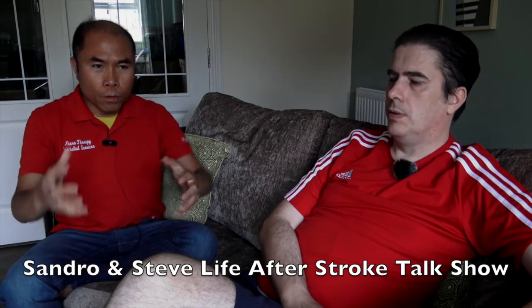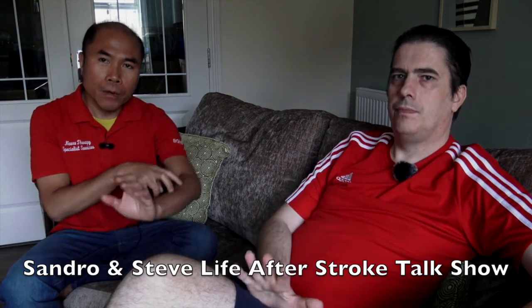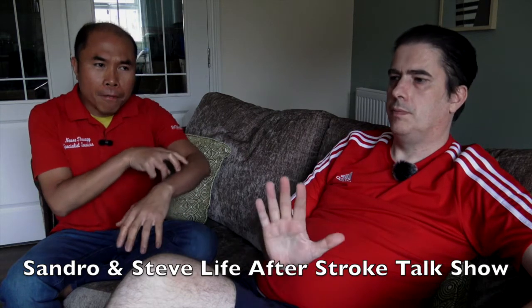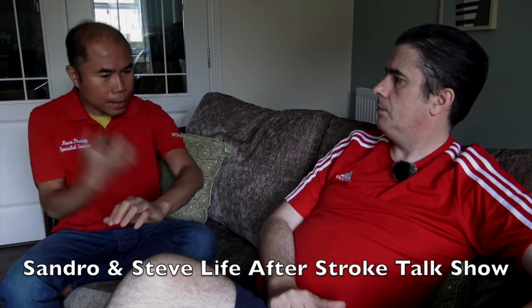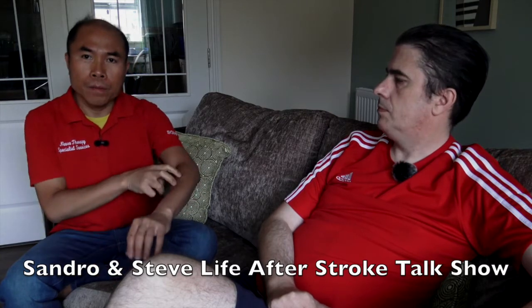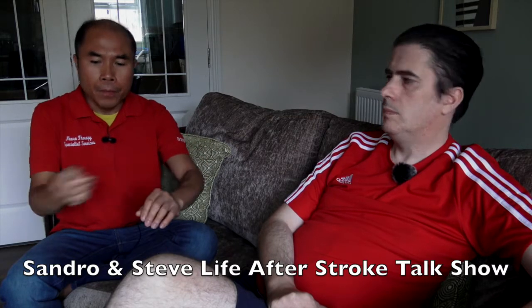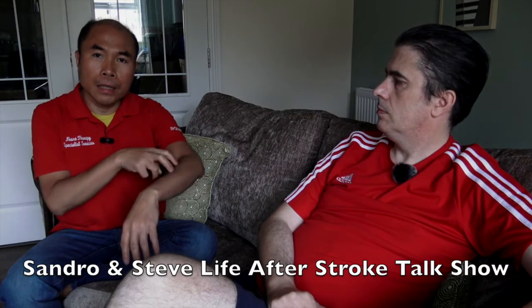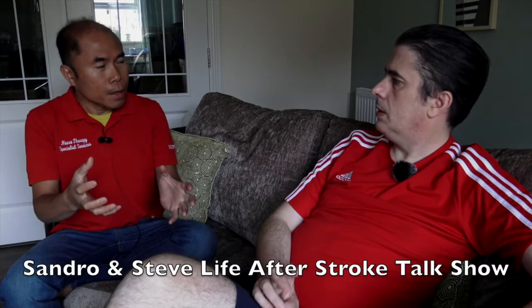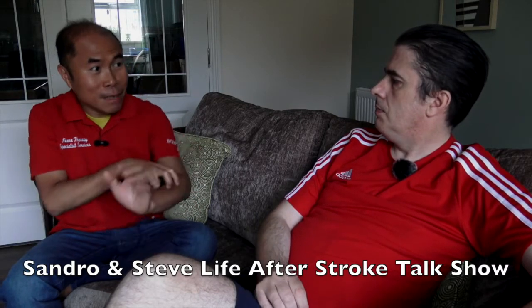So feel the electricity going through the muscle and stimulating the muscle. Feel that, and then follow it. Get the brain to reconnect with that muscle group in question, and follow what the electricity is doing. And as you learn movement, you gradually reduce the intensity of the electricity, so that eventually the time will come that there is no more electrical stimulation. There is just the brain controlling it.